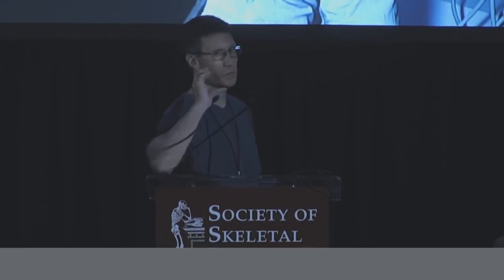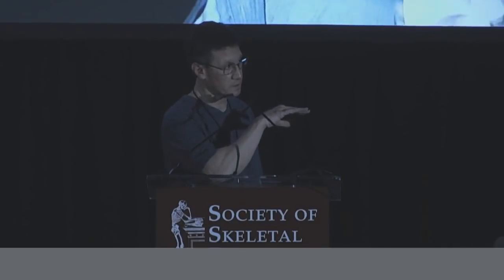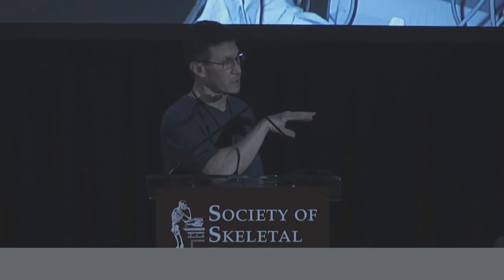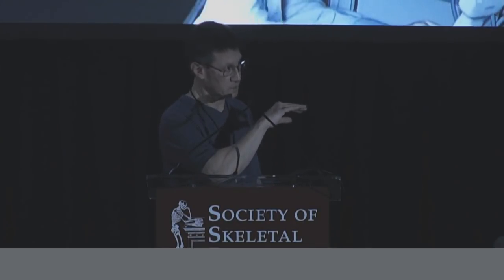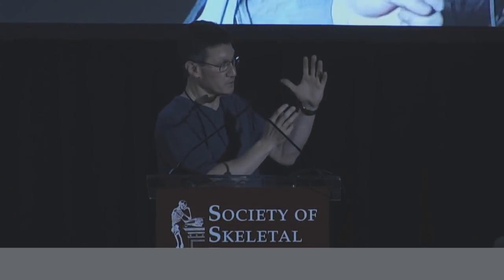So the question was, when we do a diagnostic injection for ischiofemoral impingement, where am I putting my needle? Yes, I'm putting it along the superficial aspect of the quadratus femoris muscle, staying away from the sciatic nerve because I don't want to numb up their nerve. And then I go through the muscle and go deep to it and inject there as well. Because when it's getting impinged, both the superficial and the deep sides are getting squashed. So I want to numb up both sides.